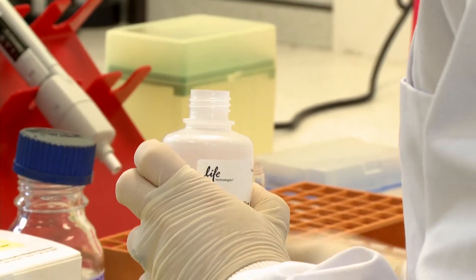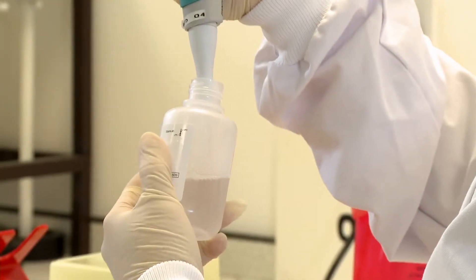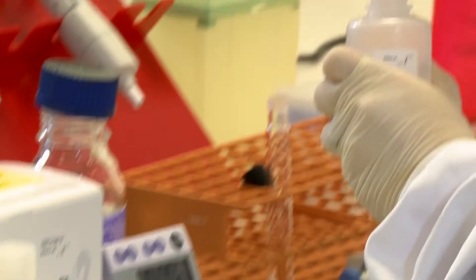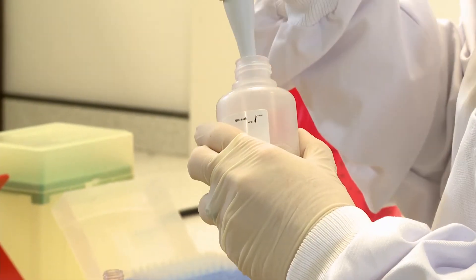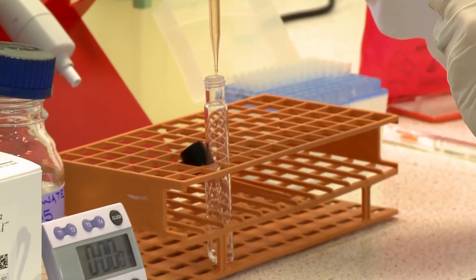Firstly, add one milliliter of SL buffer A and one milliliter of SL buffer B to an L10 tube. Buffers should be allowed to equilibrate to room temperature between 16 and 22 degrees centigrade prior to use. Standard L10 tubes and caps should be used with no cracks or crazes.